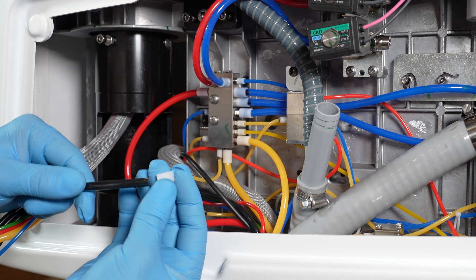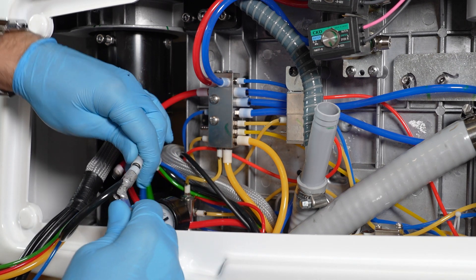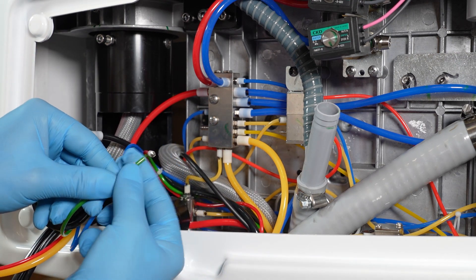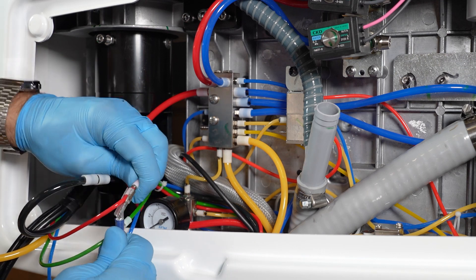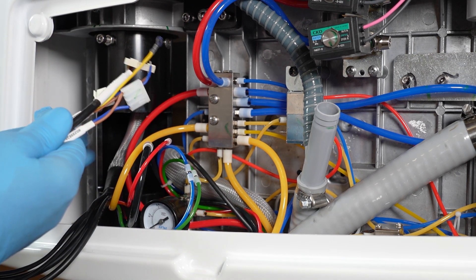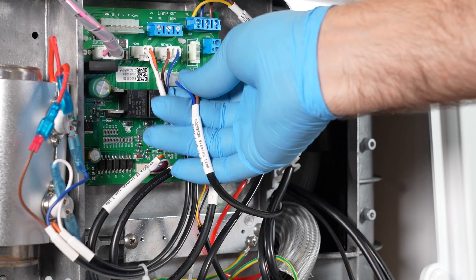Connect the pipes to the water unit respecting the colors. Move the cables up to the other side of the water unit and connect them to the water unit control board.